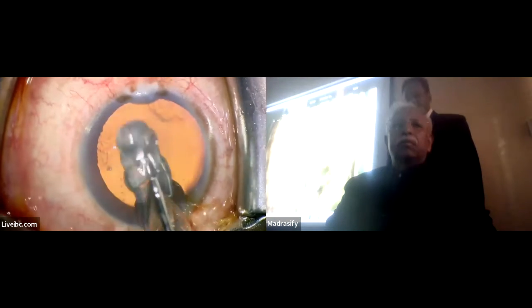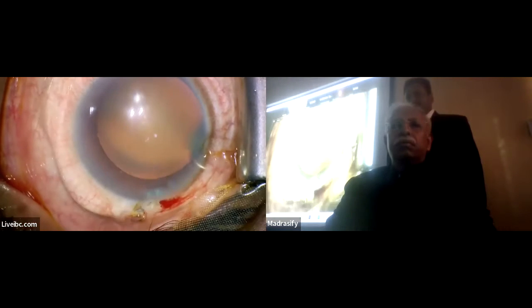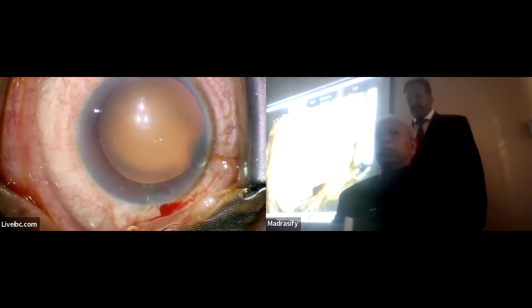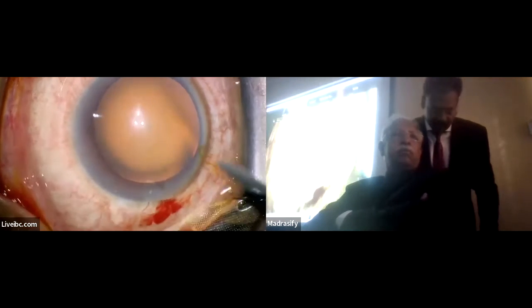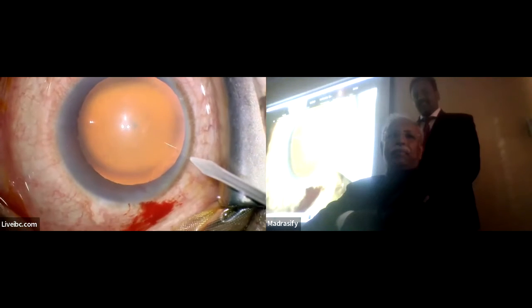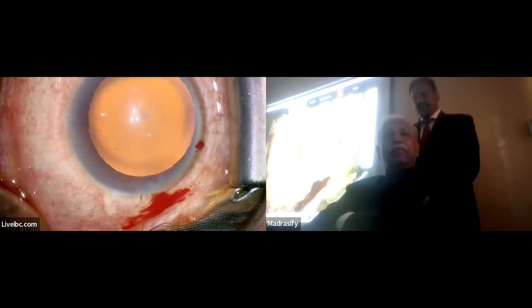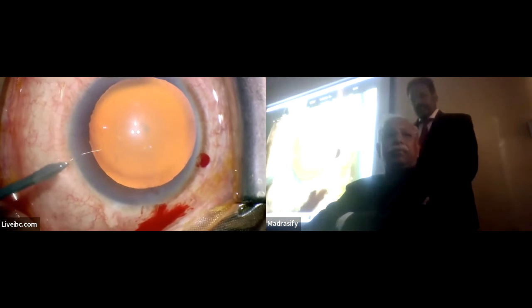Just again injecting HPMC. Make the incision at a place where you think it is ergonomically comfortable for you to place your instruments.